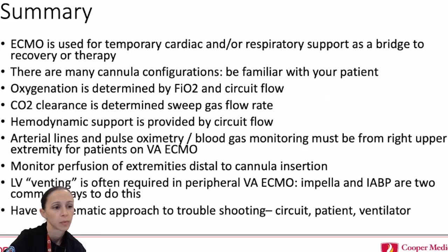And then we talked about LV venting, so that the LV, because it's weak and not contracting well and we're competing with the ECMO circuit, can get distended and clot off. So ways we can empty it would be through balloon pump or Impella. And then we talked about a systematic approach to troubleshooting.